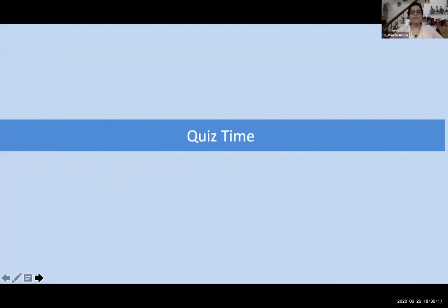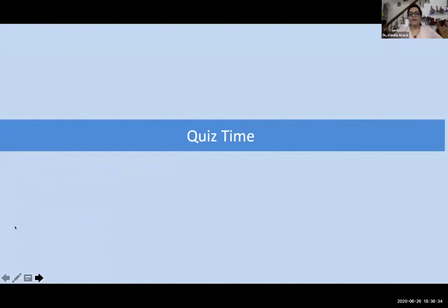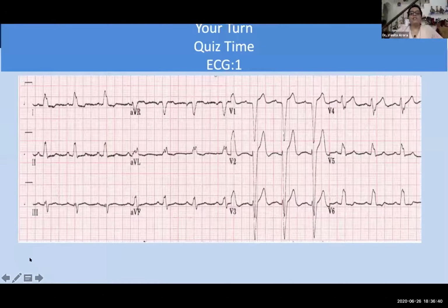Jeremy, was that you? Hi, this is Jeremy. Yeah, was that an indication? I heard some noise. Okay, so can we show these 3 ECGs as the quiz time for everybody? Do we have time for that? Yes, please. Okay, great. So this is the first ECG.